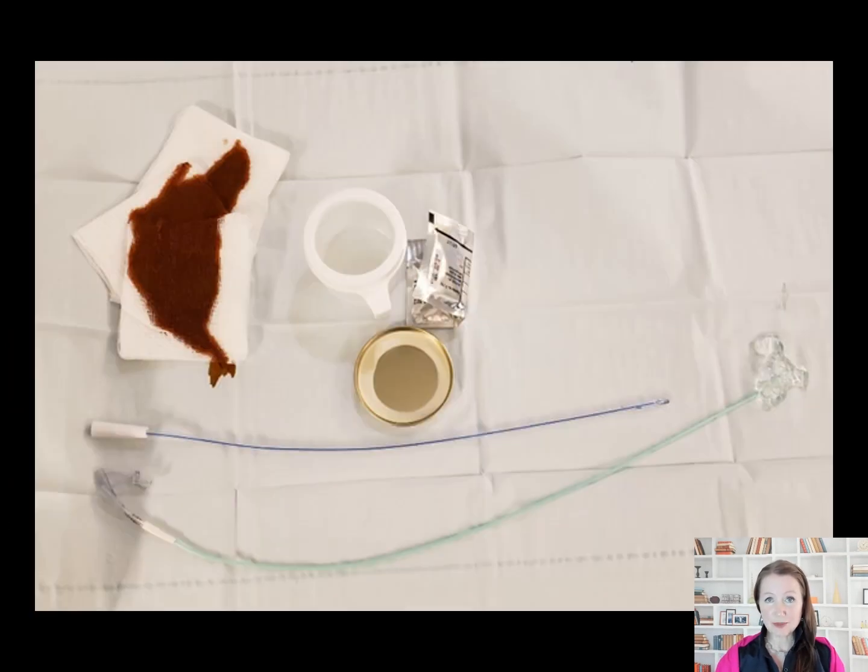Urethral catheterization will be sterile. Unless there are issues of pain or difficult catheterization, the urethra is catheterized twice — first for post-void residual and next to place the smaller dual-lumen urodynamics catheter. A triple-lumen catheter can be placed if a formal urethral pressure profile will be conducted.